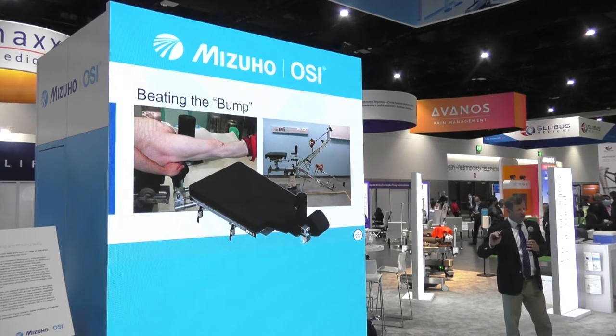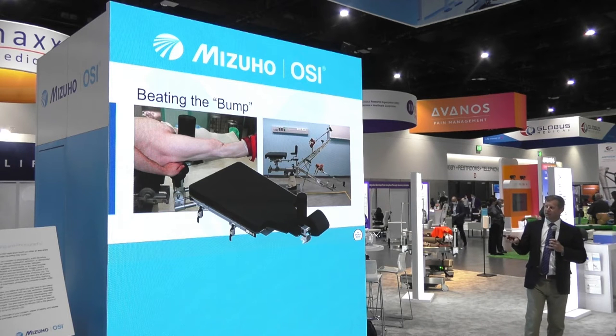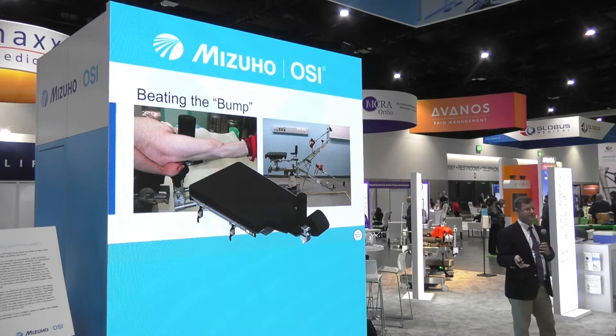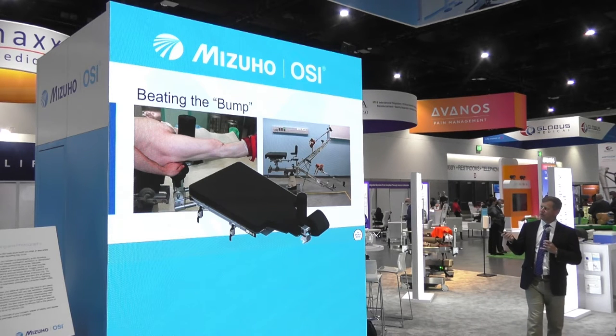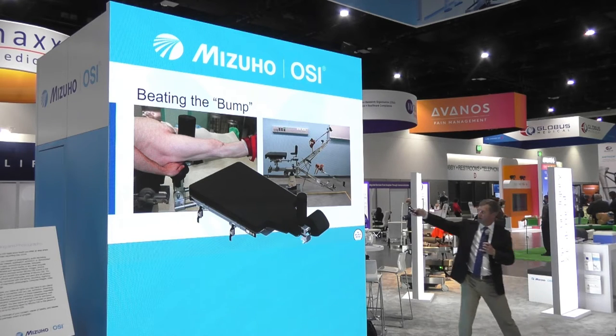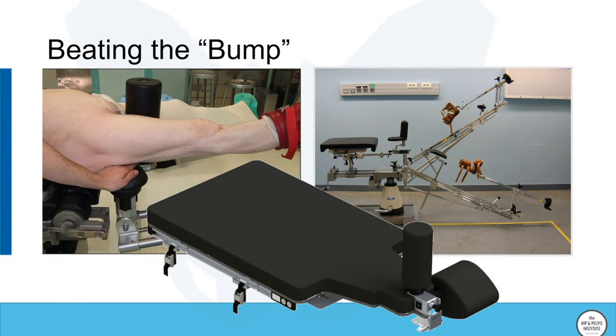The other tables out there that don't use the hook typically rely on the bump, but the bump has been around for eons now. You can see this on the original Jude table, as a lifter for the femur. It's this leg pad that you see adjacent to the spar. That's dropped down, and that's used to lift the whole femur.